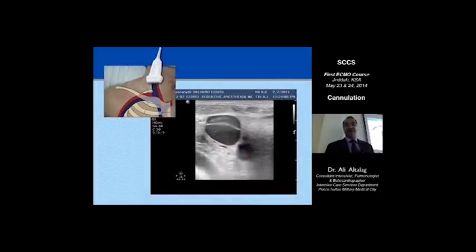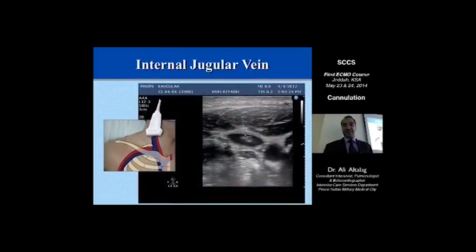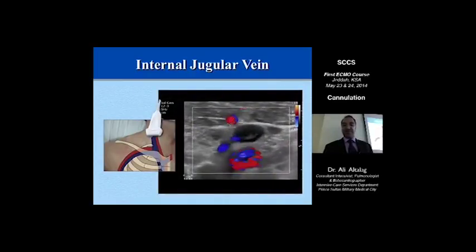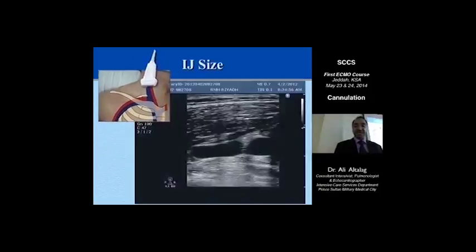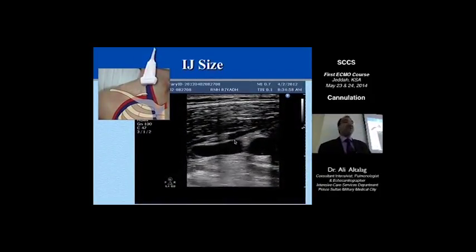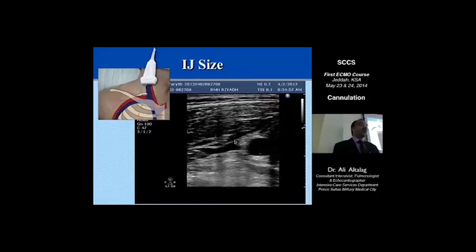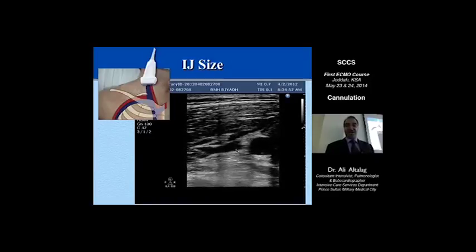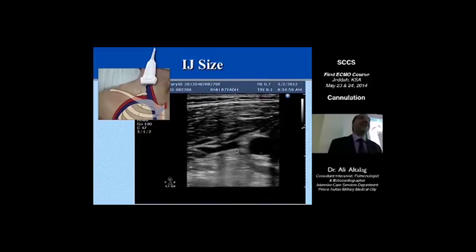Another case where you have a very abnormal IJ, probably it won't stop me from putting a catheter there, but it is something interesting to see. A small IJ with a thrombus inside it, another small IJ with the thrombus inside it, multiple vessels around it. And so what do you think is wrong with this IJ? This is one of our patients and has a very funny IJ. So what do you think is wrong? So why is this IJ collapsing and dilating? Yes, excellent.